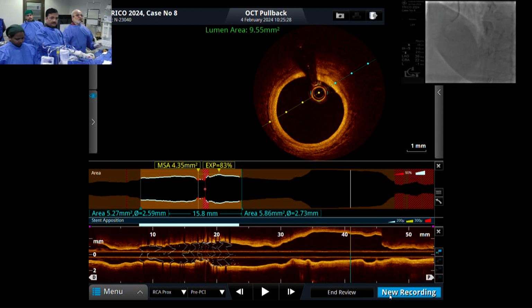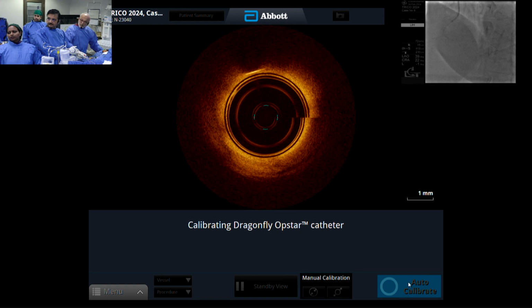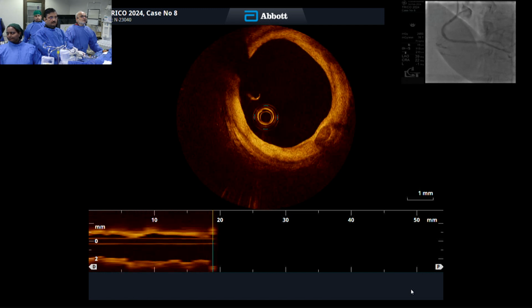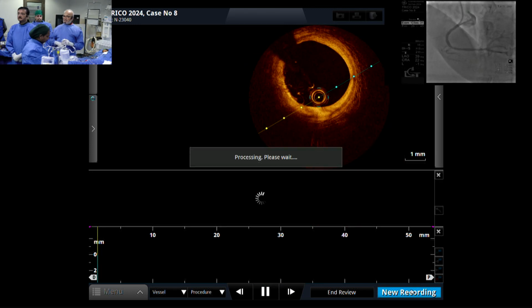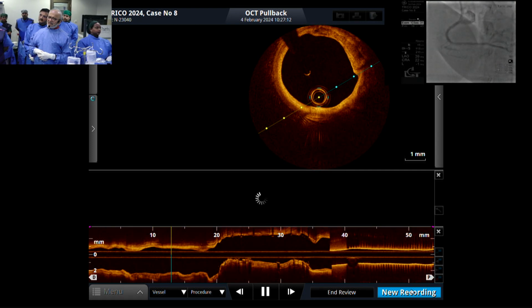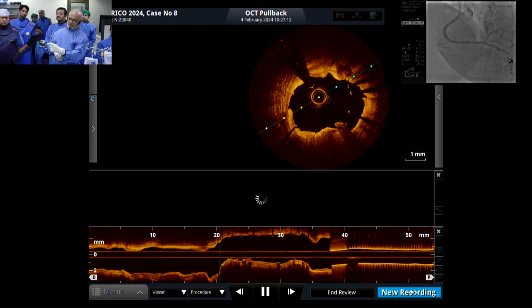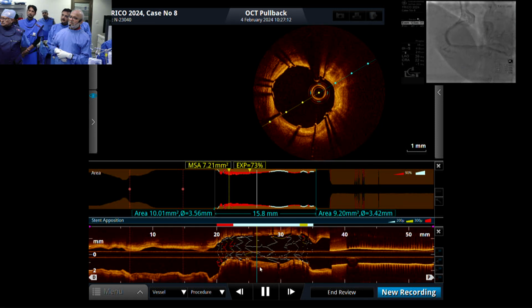Okay, let's do this view. It's a great image. Perfect. Rajiv, yesterday, the first case, we were struggling with OCT. And many of the people sitting in the audience must be thinking that they are struggling. But it happens once in a while. You saw every time there is zero default afterwards. Yeah, this is very slick watching you do this. Really quick, easy, with amazing images.